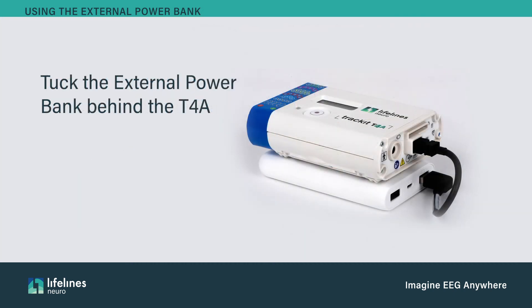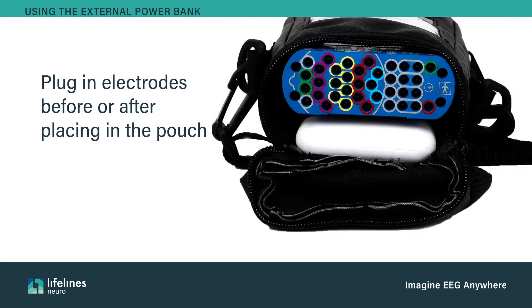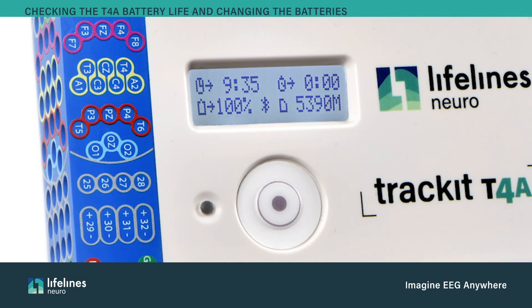If the power bank doesn't turn on automatically, press the button on the side. Tuck the external power bank behind the T4A and place both inside the pouch. Electrodes can be plugged in before or after placing the T4A in the pouch — most find it easier to plug them in before. The combined battery life of the two inserted batteries is displayed in the T4A window. If the batteries are below 5%, you must either plug in the Trackit T4A USB to amplifier cable to provide power or replace the T4A batteries.